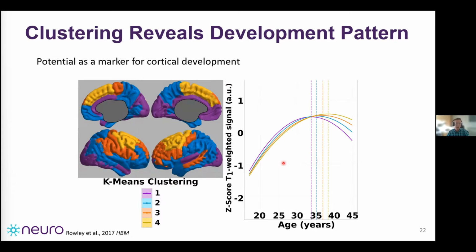So it's worth mentioning here as well that this isn't simply tracking absolute myelin content. This is most obvious by looking at the comparison with motor and visual cortices, where the visual cortices are peaking earliest at about 34 and motor cortices are peaking somewhat latest, closer to 40. And these are two very highly myelinated regions in the brain.